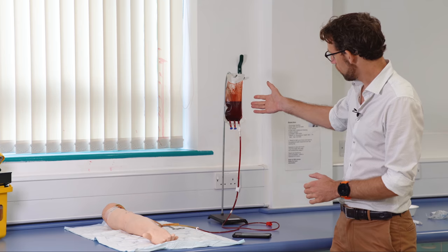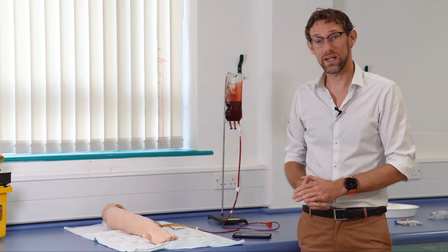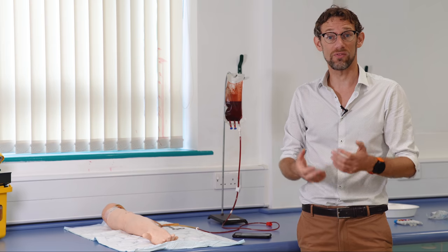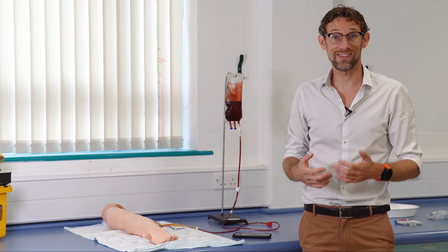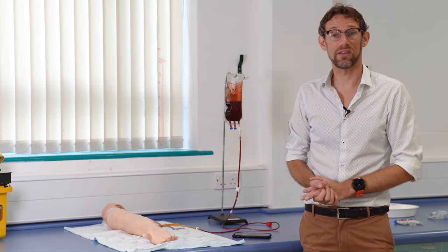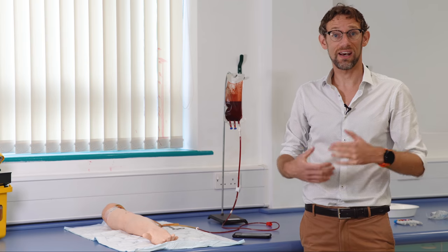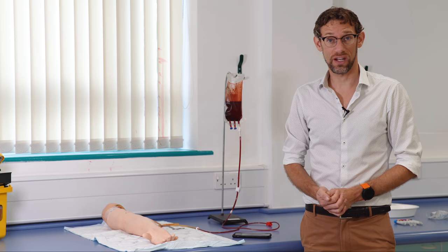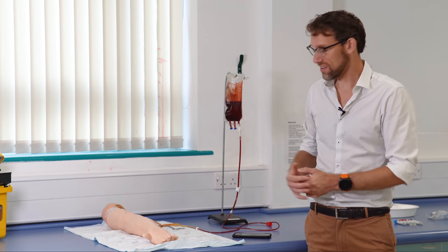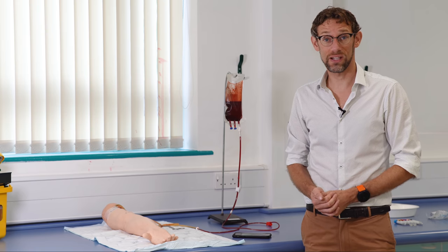These things are a very good training scenario for students because they allow us to get it wrong without actually hurting the patient. They are set up with some artificial blood and a gravity draw, so when we take the blood we should hopefully get all the appropriate stimuli — the flashback into the needle showing us we're in the right location, and then allowing us to use the vacutainer.